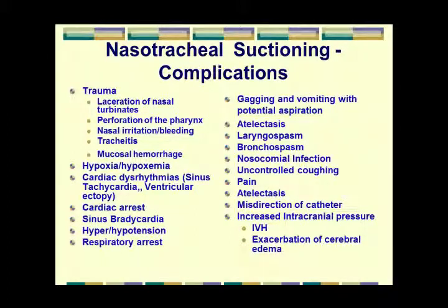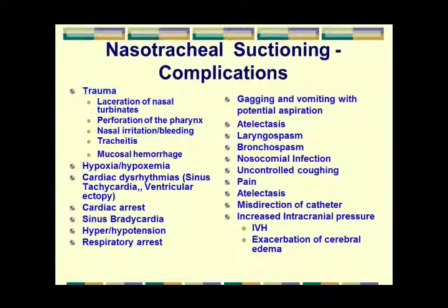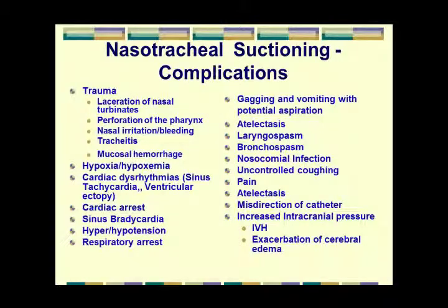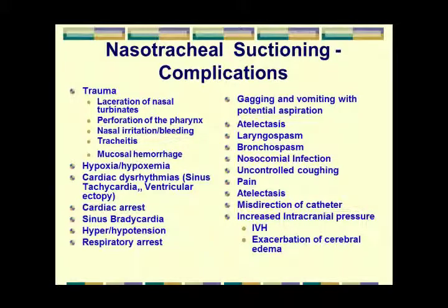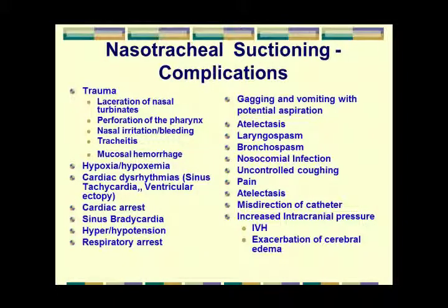Complications that can occur are the same as we talked about with the nasopharyngeal airway. You're going to have those same kinds of complications associated with it. Because I'm applying vacuum, I run the risk of also inducing hypoxemia and tissue hypoxia. Because of that, I also run the risk of cardiac dysrhythmias. Whenever the oxygen level is depleted, the myocardium can become irritable, and I can end up developing, at the very least, a sinus tachycardia, but certainly as significant as ventricular tachycardia and ventricular ectopy.